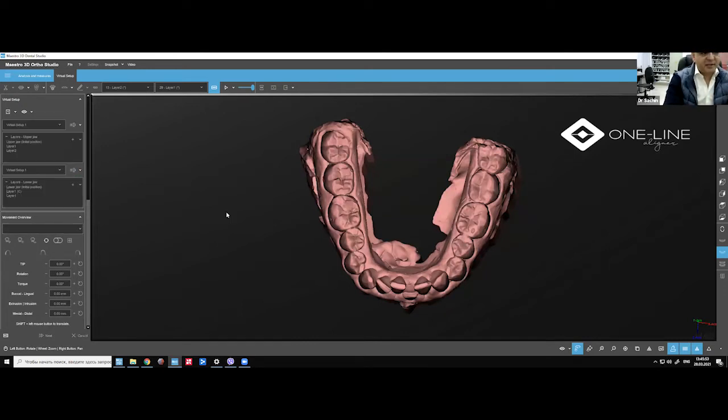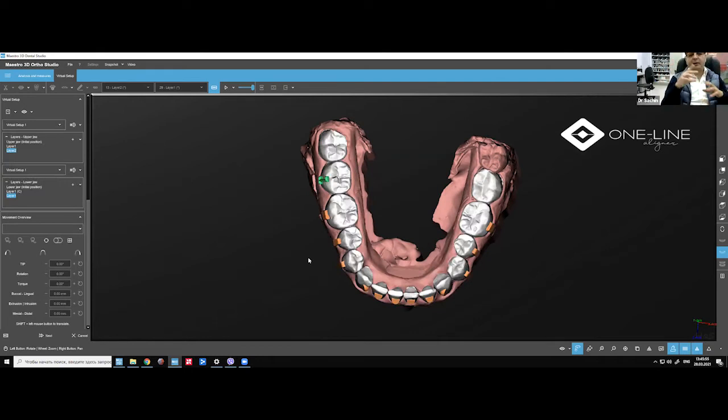So the first case which I showed you, with a very, very minor rotation, sometimes the Pro Plus is very flexible. Even after the compensation, the overcorrection that you have done, it just might not do the movement completely. So then I go on to CA.